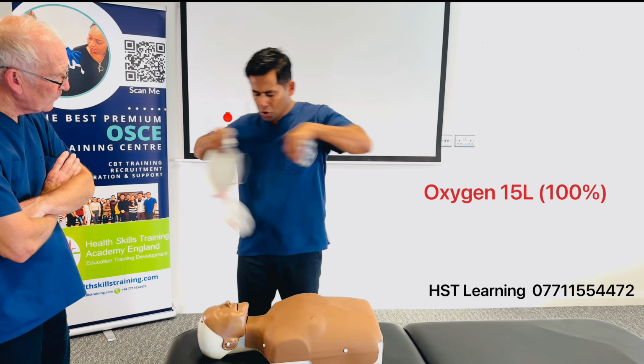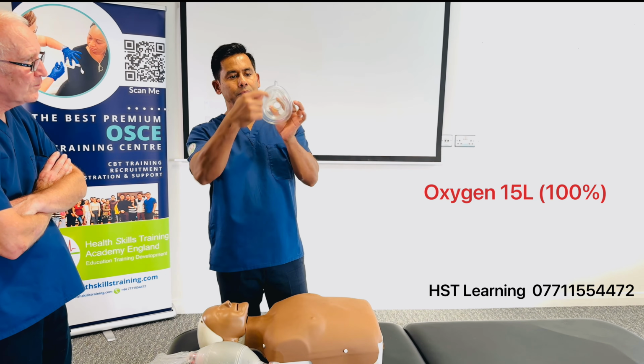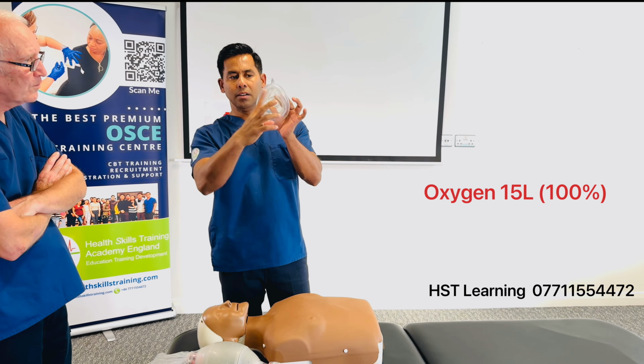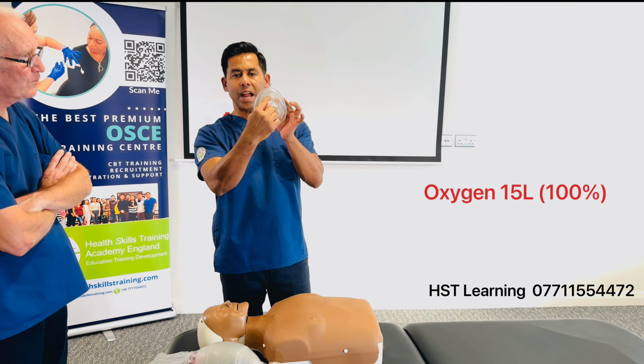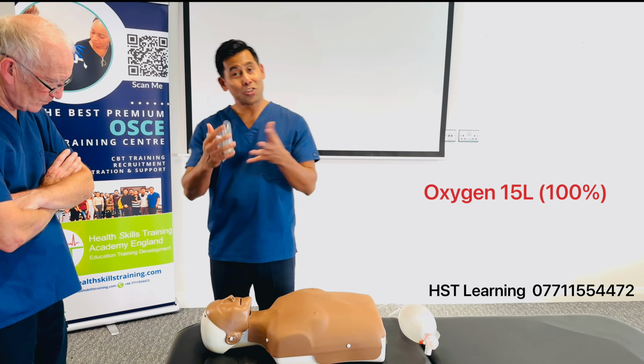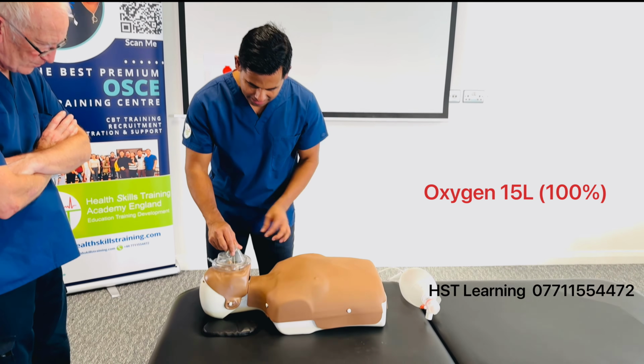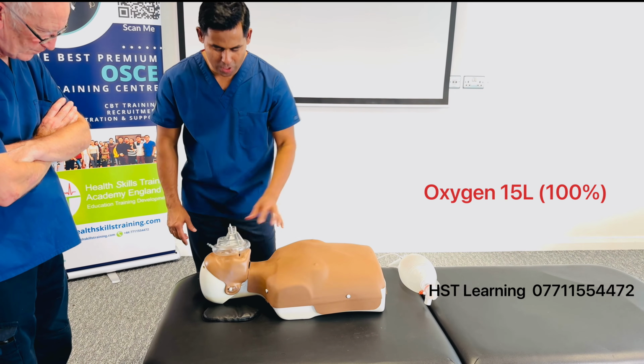So let me show you the mask here. It's a triangle. Can you see the triangle? Yes. This is the nose end. That needs to go to the nose. That is the chin end. Let me show you clearly here. So if you put it that way, now you can see how it's positioned.